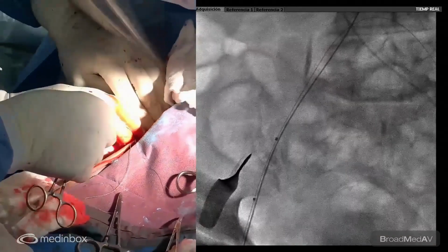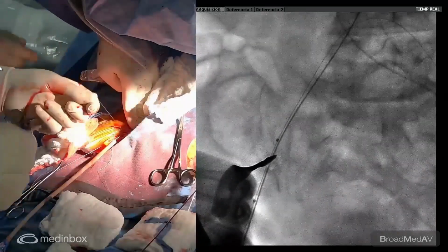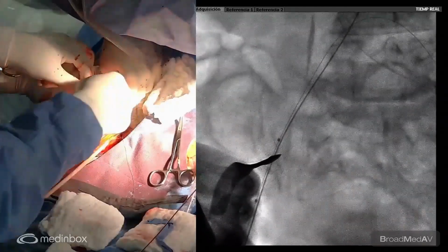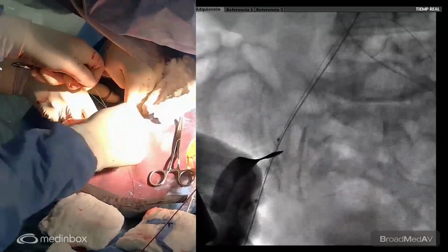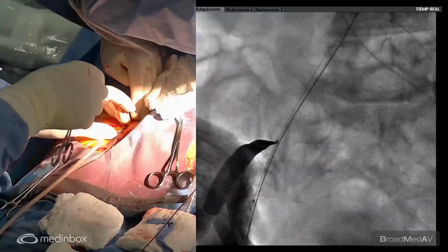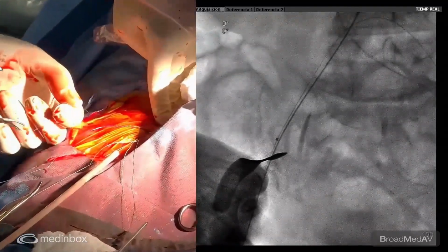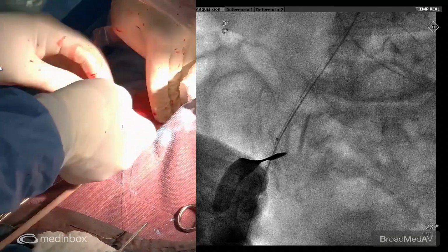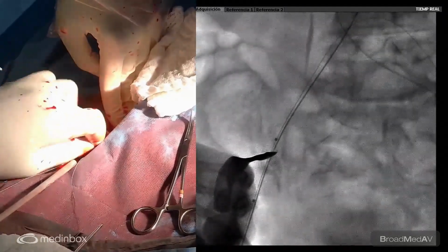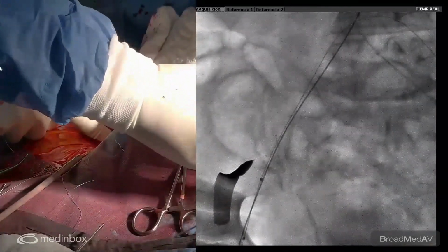Okay. Very slowly. Carlos is going to hold it and now we are closing the second suture. Let's tighten again. 2, 3, 4. And now the re-entry here inside my fingers. Now closing. Let's see. We still have bleeding there. And now, okay. We are going to close the first line. We still have bleeding there. Probably due to this, hold it here where I have my finger. And now I'm going to inflate the balloon while Jaime is.